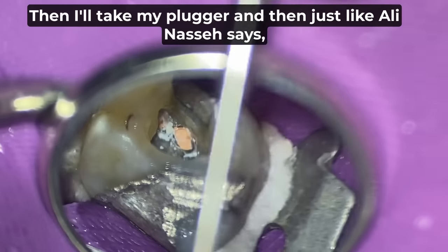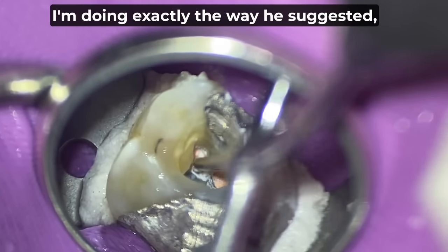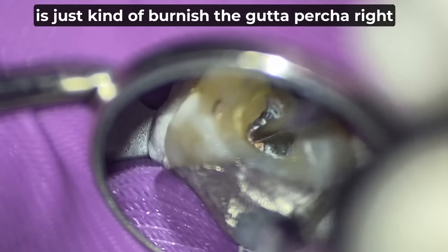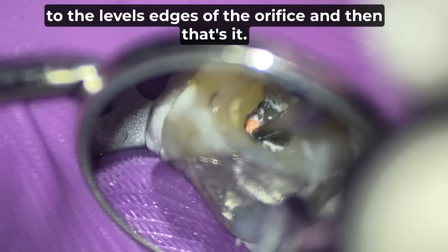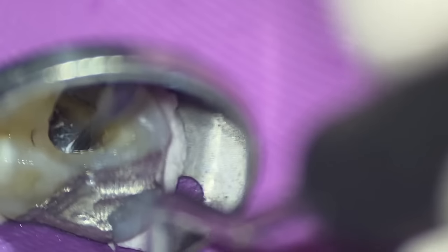Then I'll take my plugger, and just like Ali Nasseh says, I'm doing exactly the way he suggested: just burnish the gutta percha right to the edges of the orifice, and that's it.